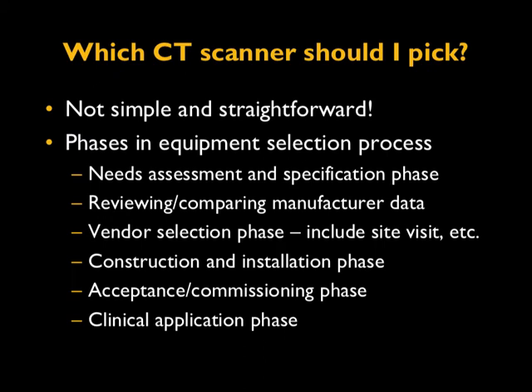So the first common question is, which CT scanner should I pick? It's not simple and straightforward, because the equipment selection process involves the following phases. First of all, one needs to assess the need and the specification phase.